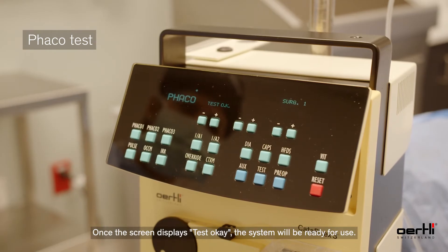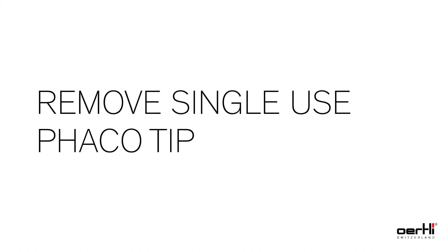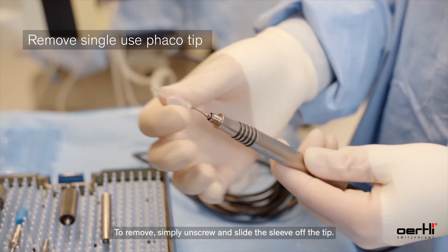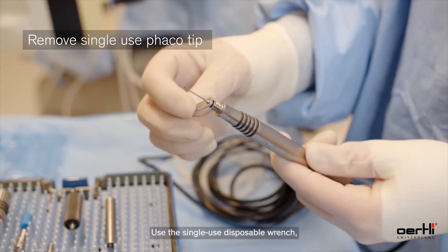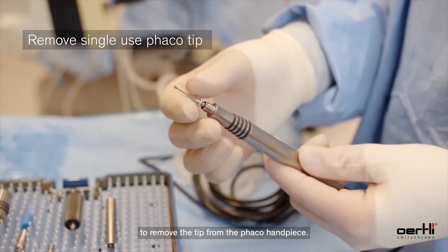Once the screen displays 'test okay,' the system will be ready for use. To remove, simply unscrew and slide the sleeve off the tip, then use the single-use disposable wrench to remove the tip from the FACO handpiece.